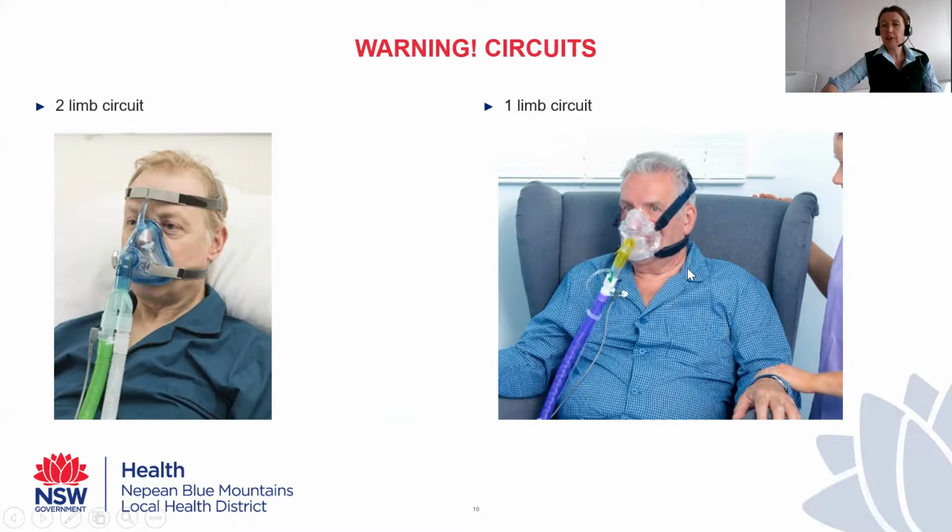If you don't have that hole or a vent in the mask, what's going to happen is the patient's going to breathe all that gas flow out with the CO2. It's going to stay in the mask. They're going to rebreathe their CO2 in subsequent breaths, and they're rapidly going to become unconscious. So it's a safety thing. Just be mindful of that.